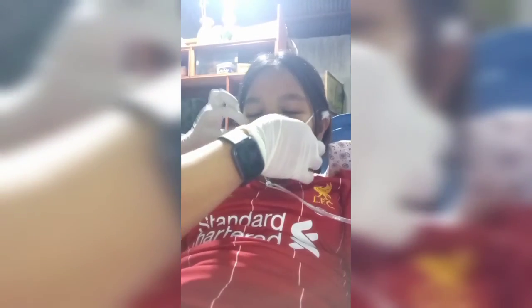Remove and clean the cannula and assess the nares at least every 8 hours or according to agency recommendation. Tanggalin ko na po, ma'am. Excuse me po. We need to check the nares for evidence of irritation or bleeding. Let me check your nose, ma'am. Okay. Clear naman po. Wala pong masakit, ma'am.